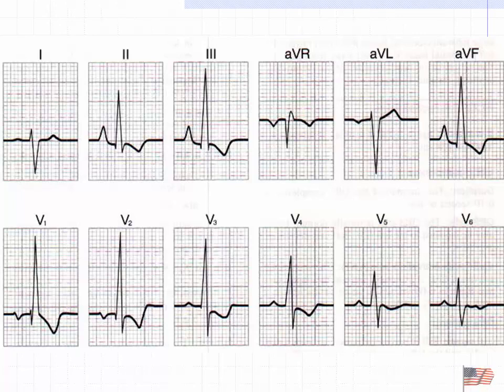That one's not, they're both positive. This is positive. No, that one's not, I'm looking at 2. Lead 1 and lead AVF are perpendicular. This says it's going left to right. That's saying it's going top to bottom. Going in this quadrant of the upper... So what quadrant is that? Lower left. This quadrant here.